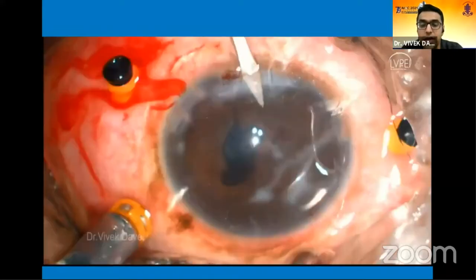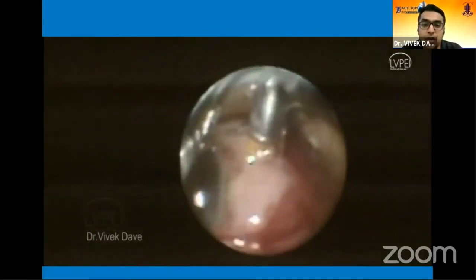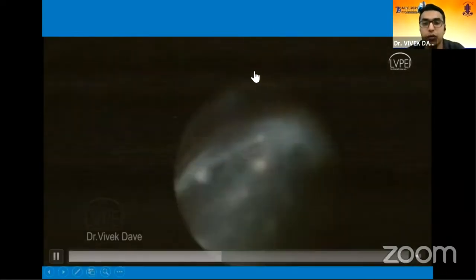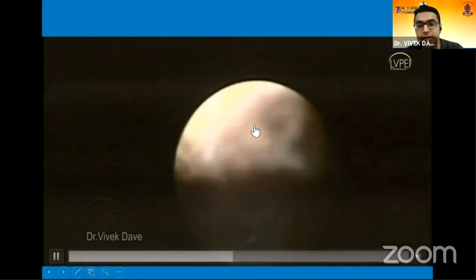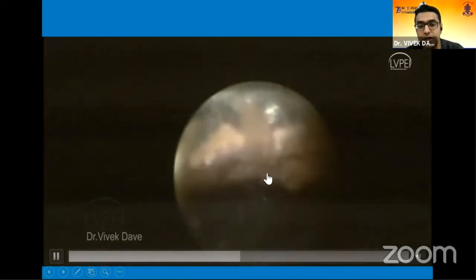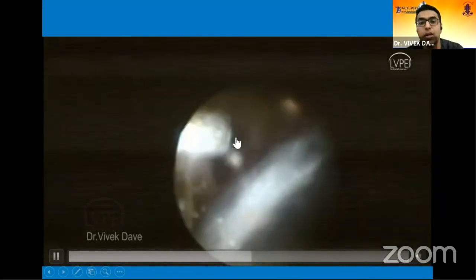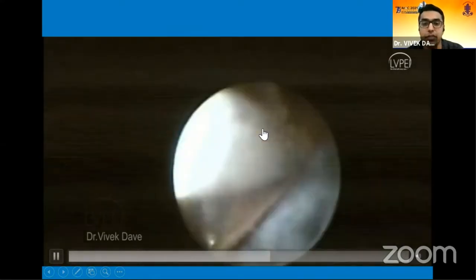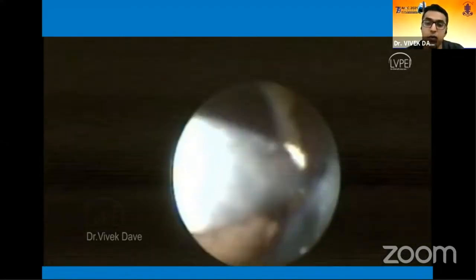We make an entry into the limbus and through the limbal entry go in with the endoscope. Here we can see the iris tissue and, in between the iris tissue and the lens, another membrane which is the cyst wall. This cyst wall is being removed by a vitreous cutter and needs to be removed completely right to its base to ensure no re-proliferation.